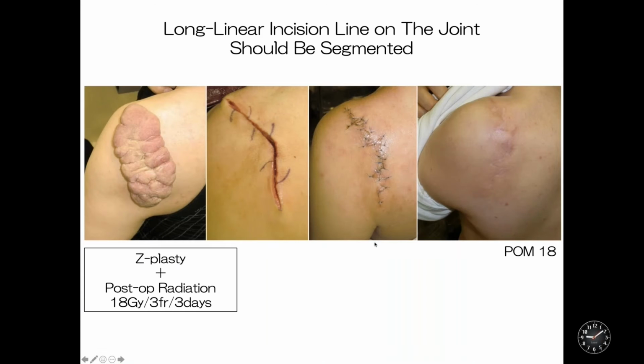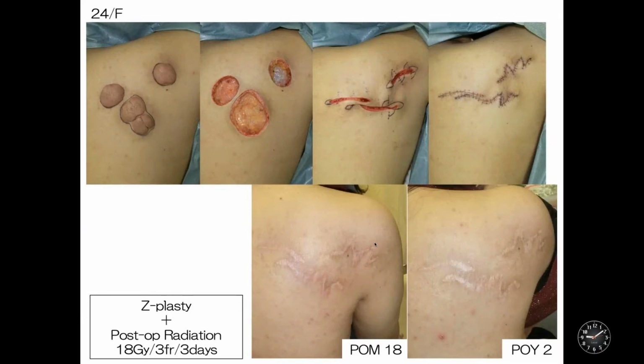And this is also scapular keloids, 18 months after surgery and radiotherapy. And such kind of thick keloids are a good indication of surgery and postoperative radiotherapy.